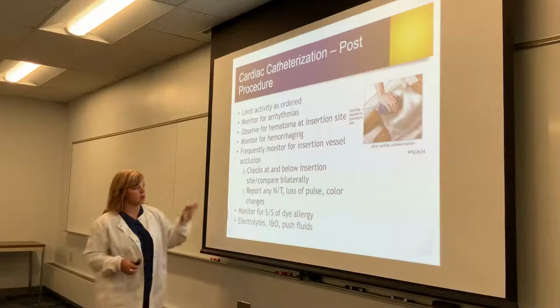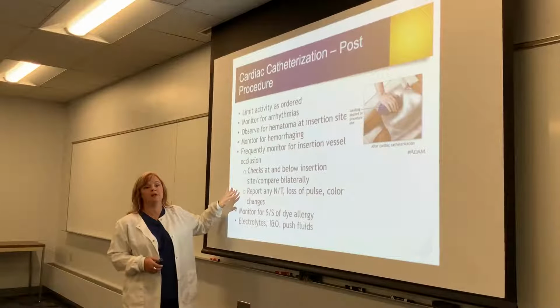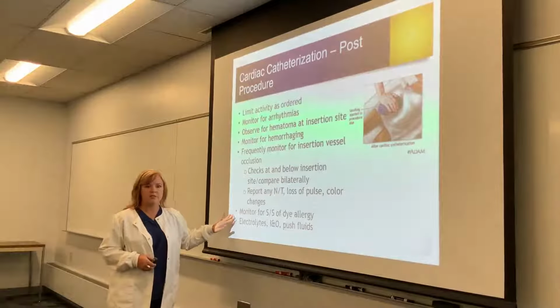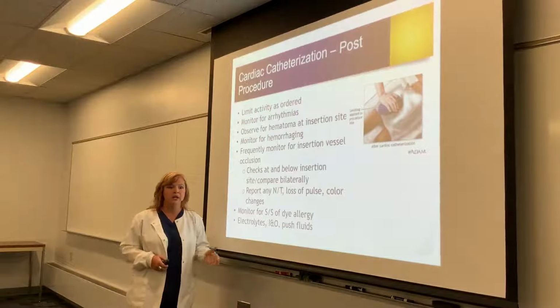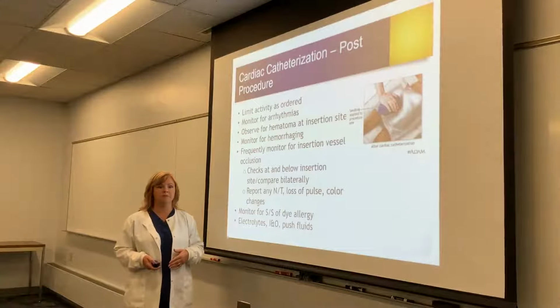And so that's why it's always a good idea to know what were these pulses beforehand because they should not be any different. You'd always be monitoring for any signs and symptoms of dye allergy, and we'd be watching their electrolytes and their intake and output after the procedure.